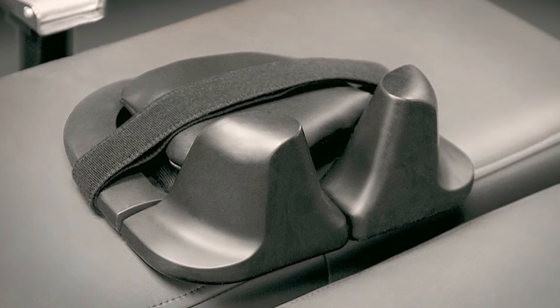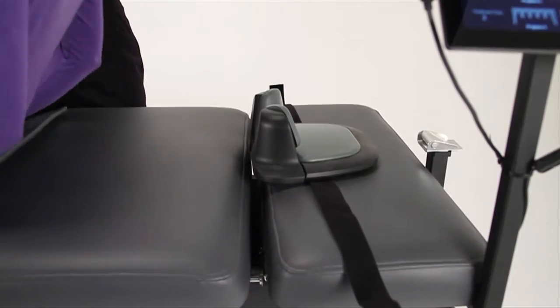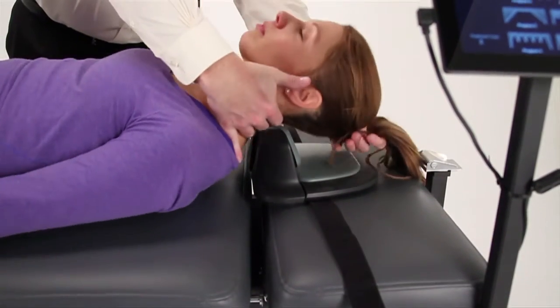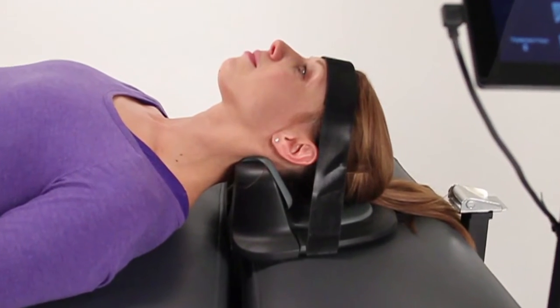Our unique cervical device cradles the head with complete encapsulation of the occiput. Fully adjustable, cushioned, and contoured, patients experience a customized support system for maximum comfort and effectiveness.